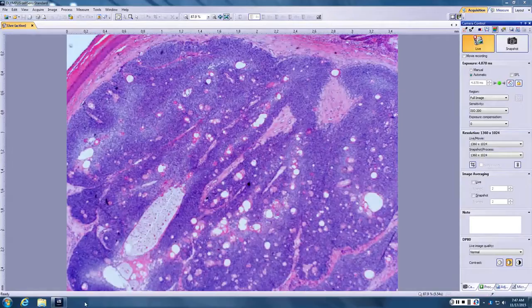I was going to say palisaded, but it's not. No ducts in pilomatricoma, although they are blue. Anyone want to jump in? Sebaceous tumors. So blue with red ducts. So red nodule with ducts is an acrospiroma. Blue nodule with ducts, sebaceous. Red with ducts, acrospiroma. Blue with ducts, sebaceous.